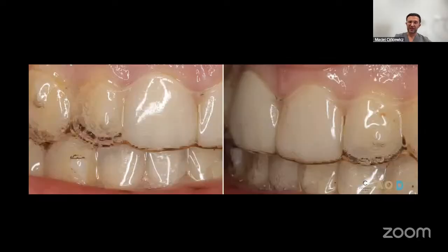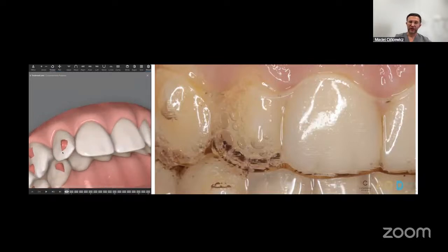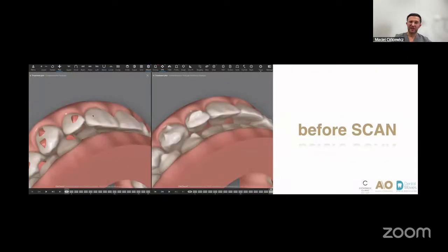So if you can see here, when we have the rotation of this lateral incisor, we are losing it. We don't have tracking, and the fitting is not very good here. We can see it, of course, but sometimes we can add additional elements of composite here. So we correct during the visit. We are not wasting our time waiting for the animations and thinking about it.